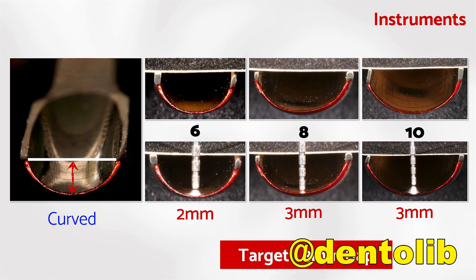If you intend to take 3 millimeters of bone in thickness, when we use number 8 and 10, the edges of this tool should be coincident with the outer portion of the tuberosity. When we use number 6, we need to go 1 millimeter deeper in order to take 3 millimeters in thickness.